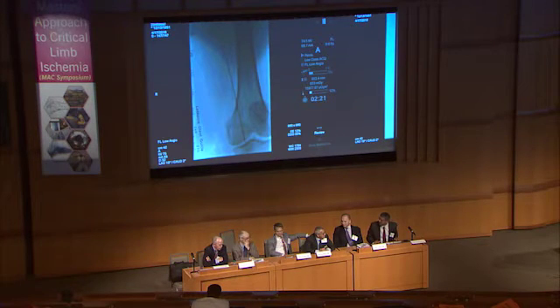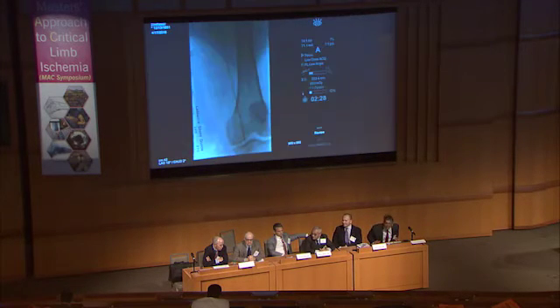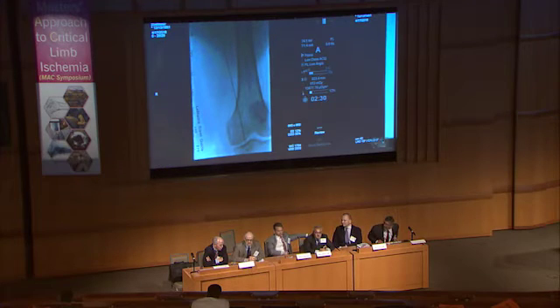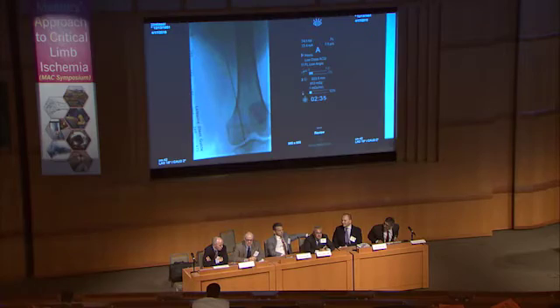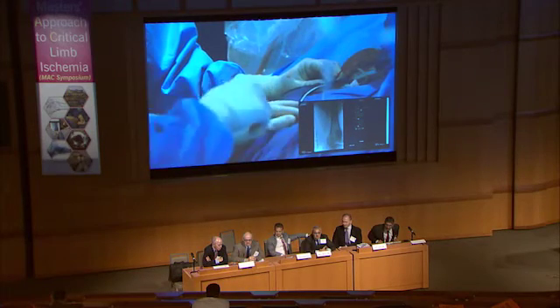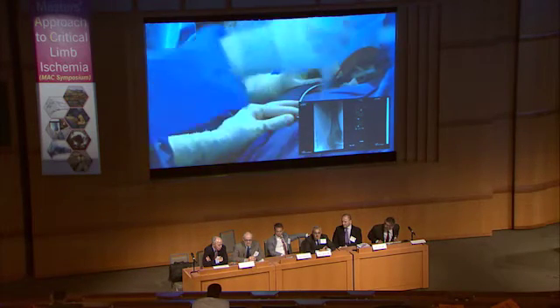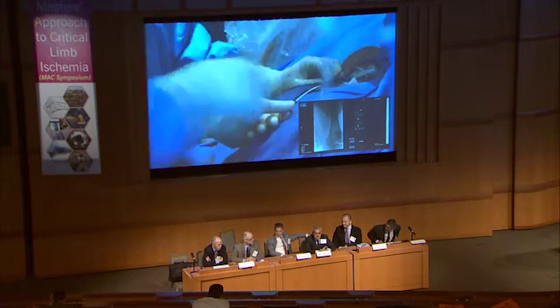So Thomas, we always learn from Germany how you can achieve good results with low cost. So the question to you is, would you use IVUS in this case? No. To be honest, I wouldn't. In Germany, it's not reimbursed, so it's expensive for the institution. And what we saw is the inflated balloon. We saw the reference vessel diameter, so we can more or less calculate the right size of the Viabahn, and I believe 6 is okay. The vessel does not look very calcified, and if you post-dilate the Viabahn with a 6 millimeter balloon with high pressure, then it should be opened.